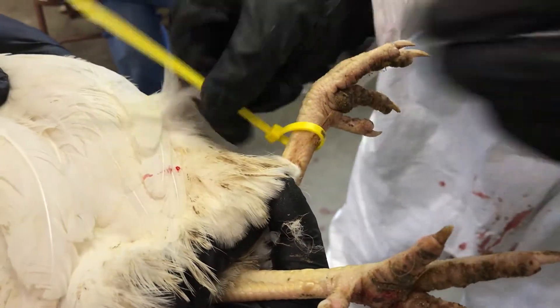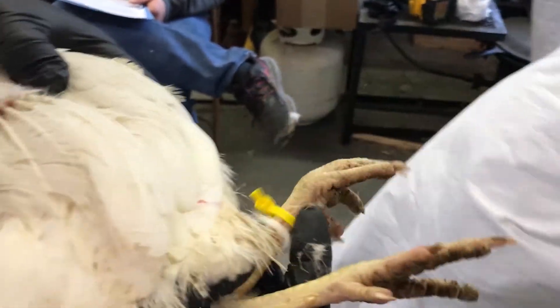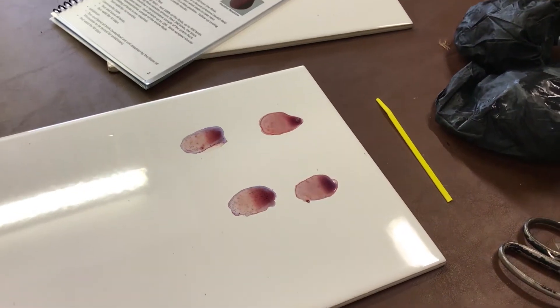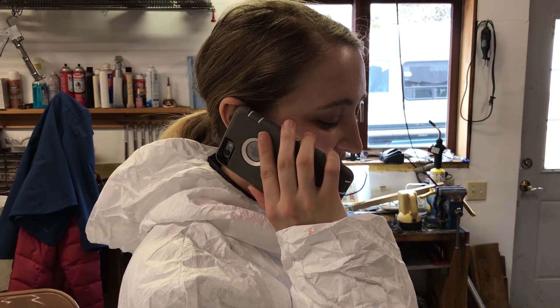All birds tested by the rapid whole blood test for sale or exhibition must be banded. Any bird that reacts on the rapid whole blood test must also be banded. Write the band number of the bird on the test report to indicate that it reacted. Call the board at the Minnesota Poultry Testing Laboratory or a Board of Animal Health representative to report the reaction. Keep the reactor bird separate from the rest of the flock until the testing results can be confirmed.